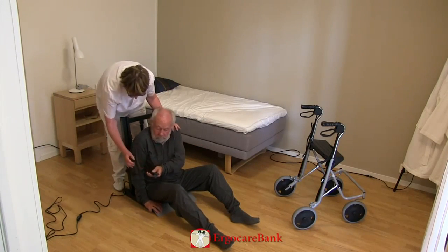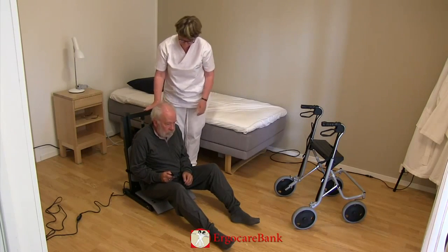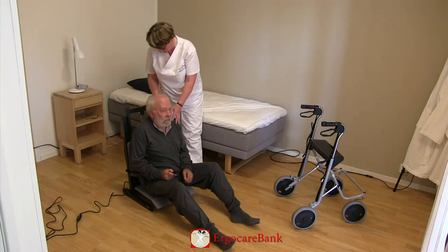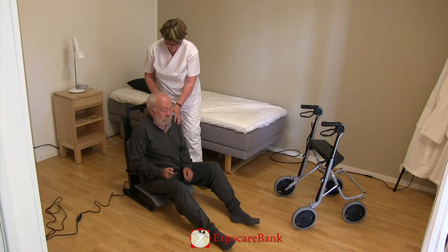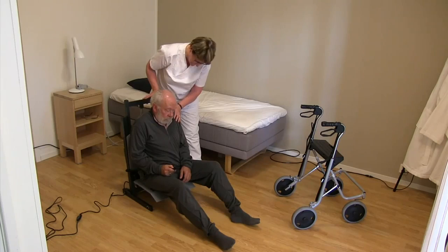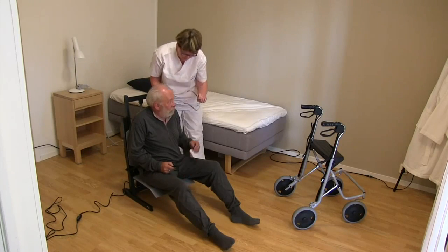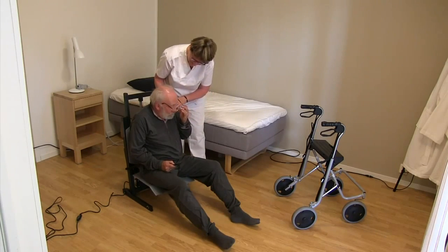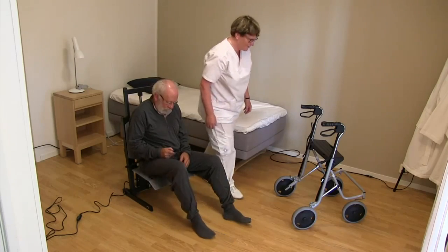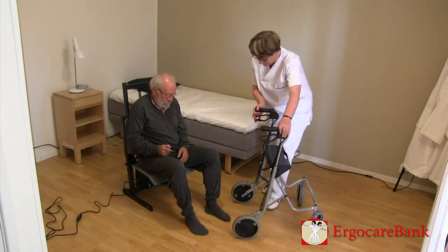Burt is given the control for the stand-up and can raise the seat himself. The staff member then puts Burt's four-wheel walker in front of him.